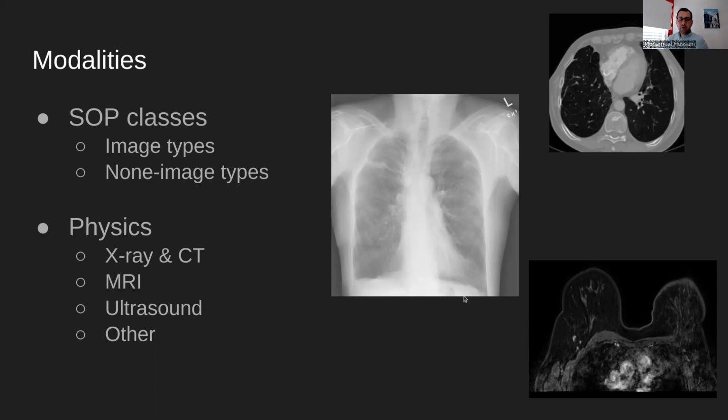Now, a lot of the time you may hear people talking about 2D versus 3D images. 3D images are the ones that are captured as slices. If they're scanning my chest, it's taking slices across my chest going all the way up. Then these can be constructed into a 3D image and processed accordingly, versus something like a chest X-ray, which is just a single picture and that's it. It's almost like the concept of capturing a movie on your phone versus a single picture.